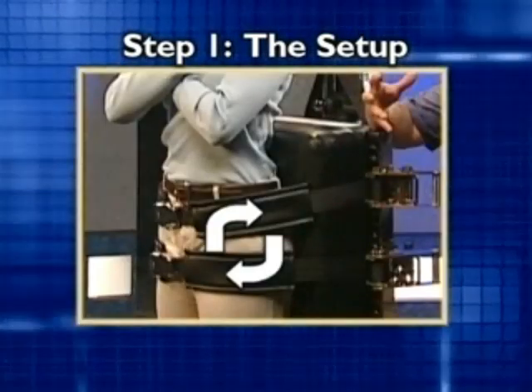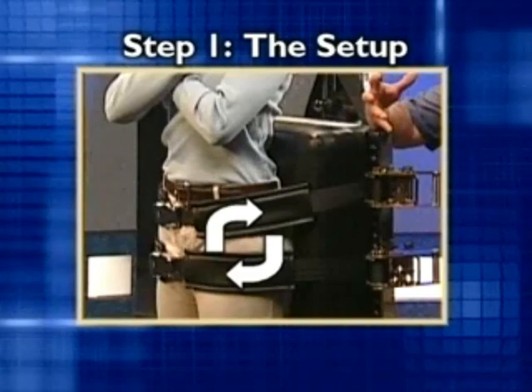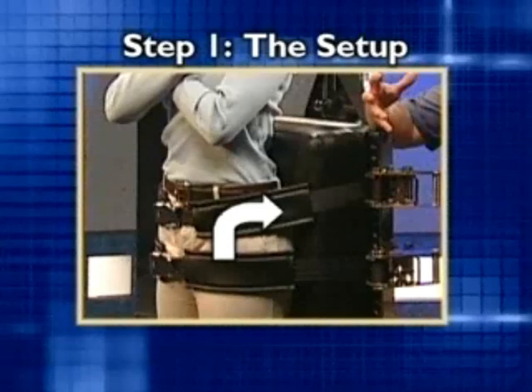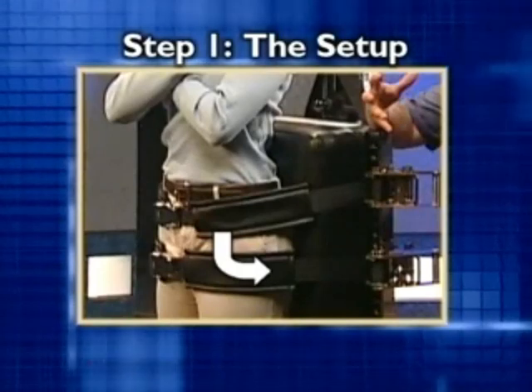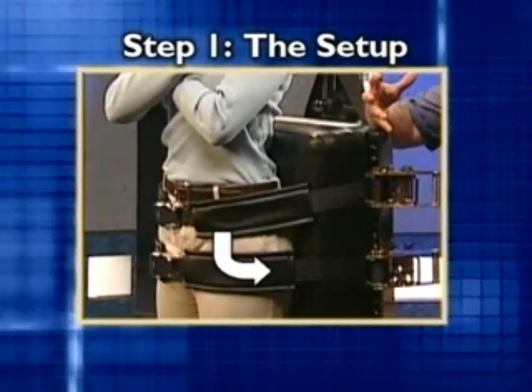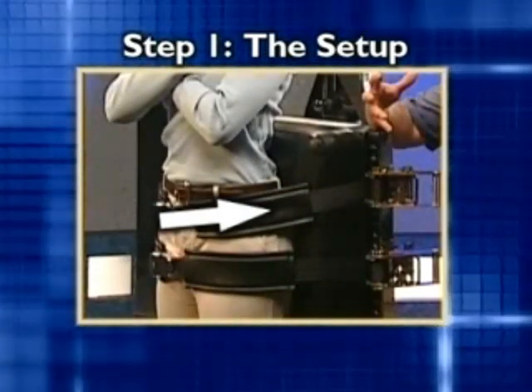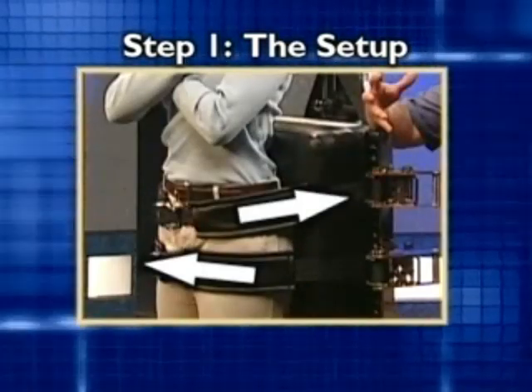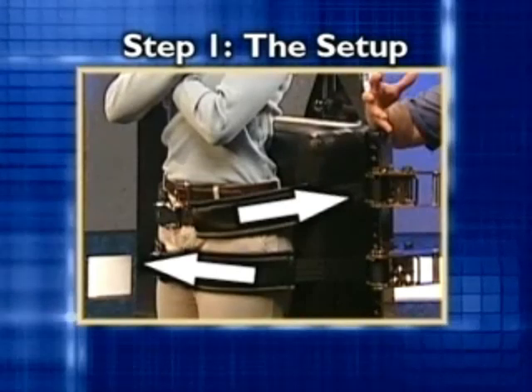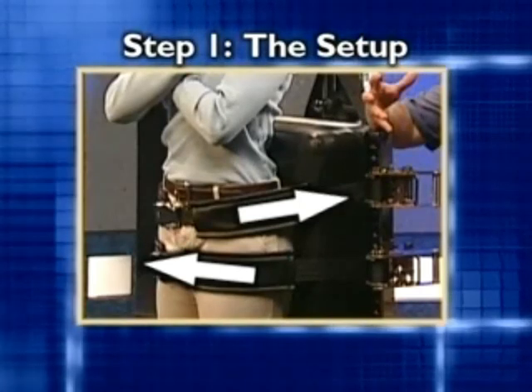If both ratchets on either side of the same restraining belt are operated simultaneously, rotational forces in the sagittal plane will occur. If the top restraining belt is pulled, posterior pelvic tilt takes place. If the bottom belt is pulled, anterior pelvic tilt occurs. Tightening only one ratchet causes rotational movement in the transverse plane because of the belt's friction on the body. When two restraining belts are placed around the pelvis, pulling the top left ratchet and the bottom right ratchet at the same time creates torsional forces on the pelvis.